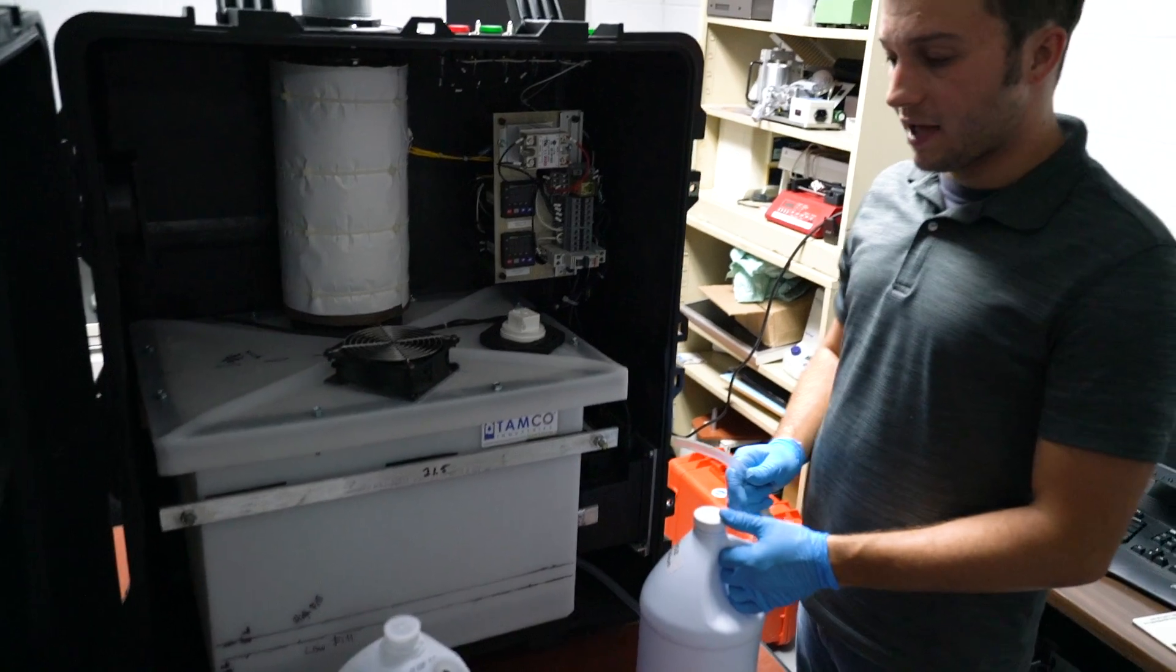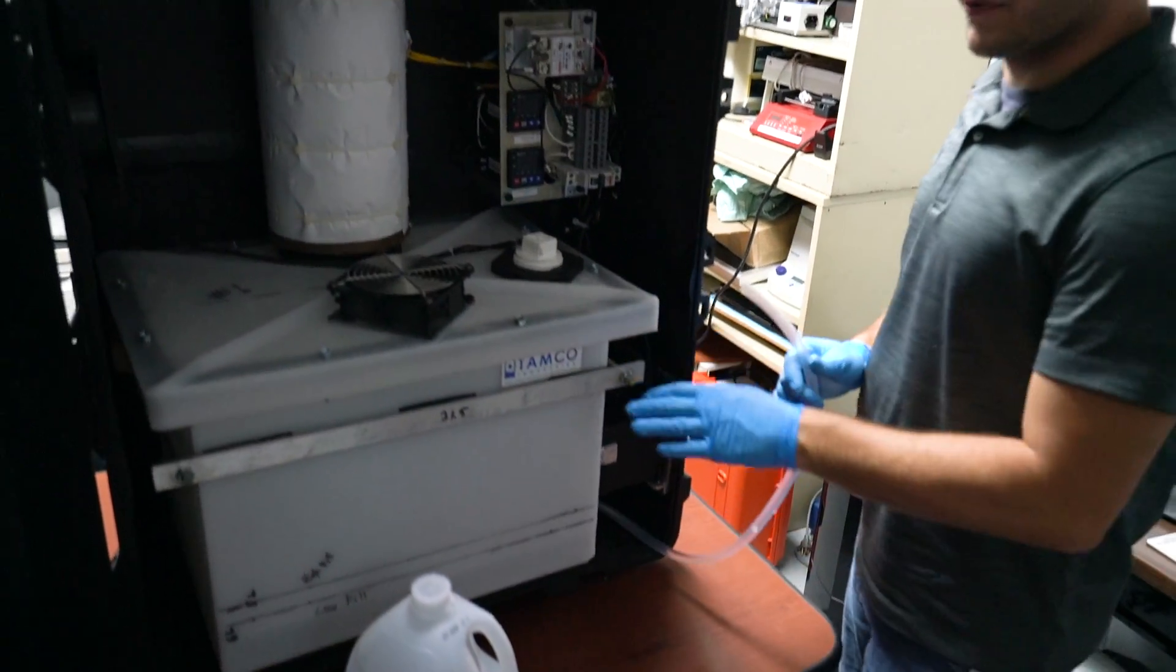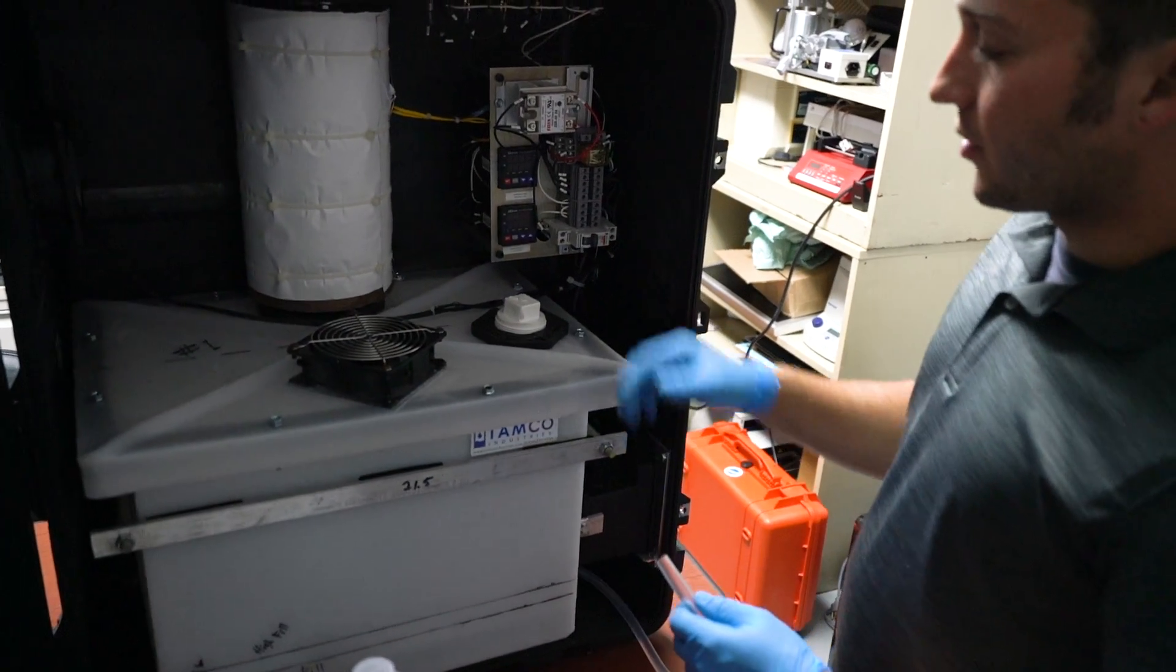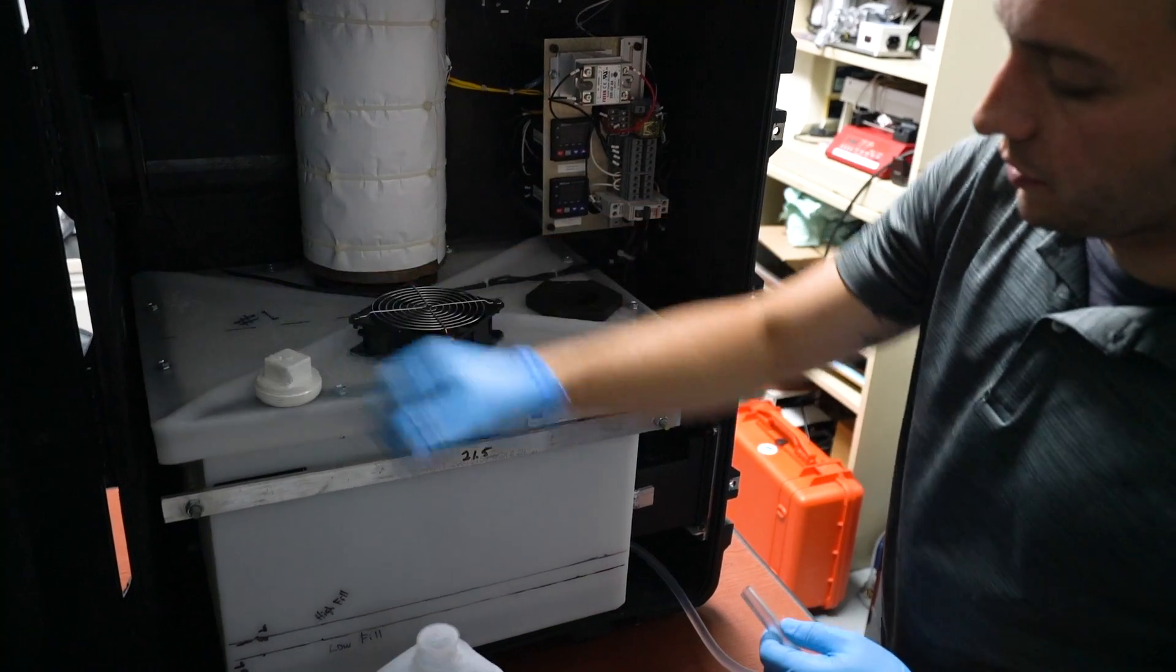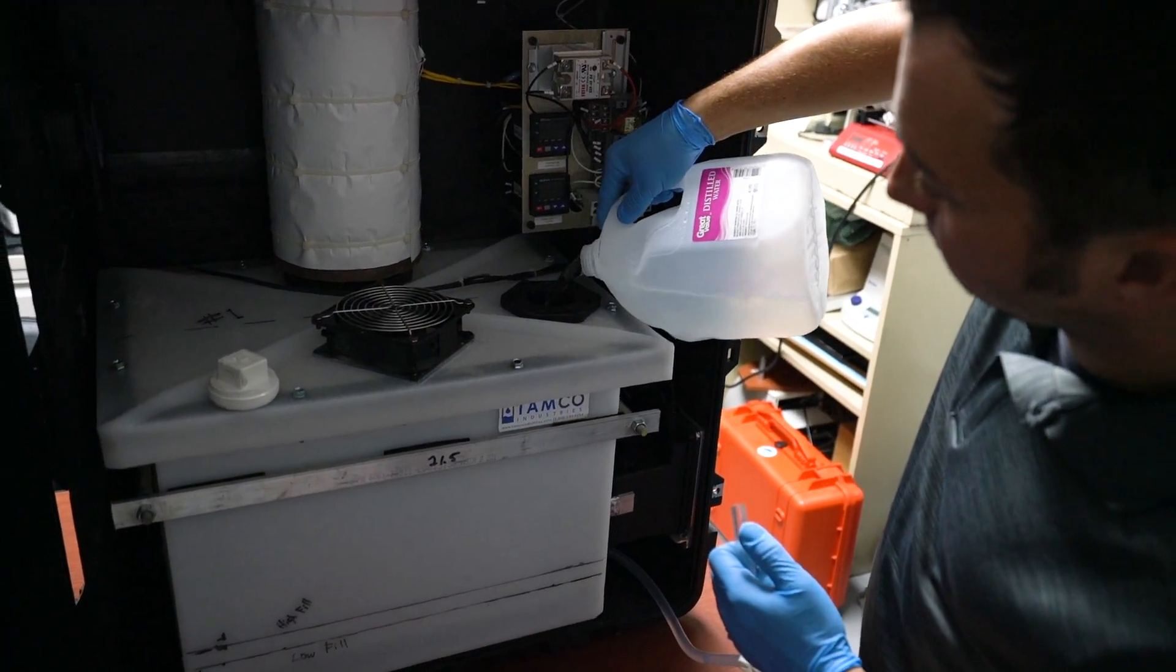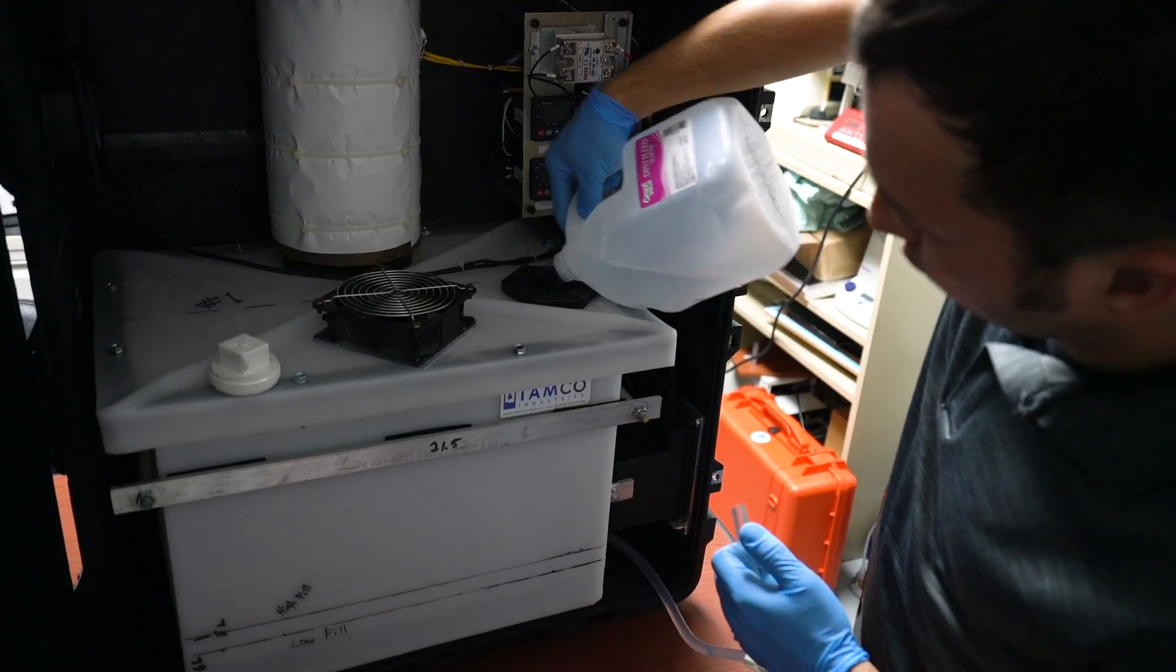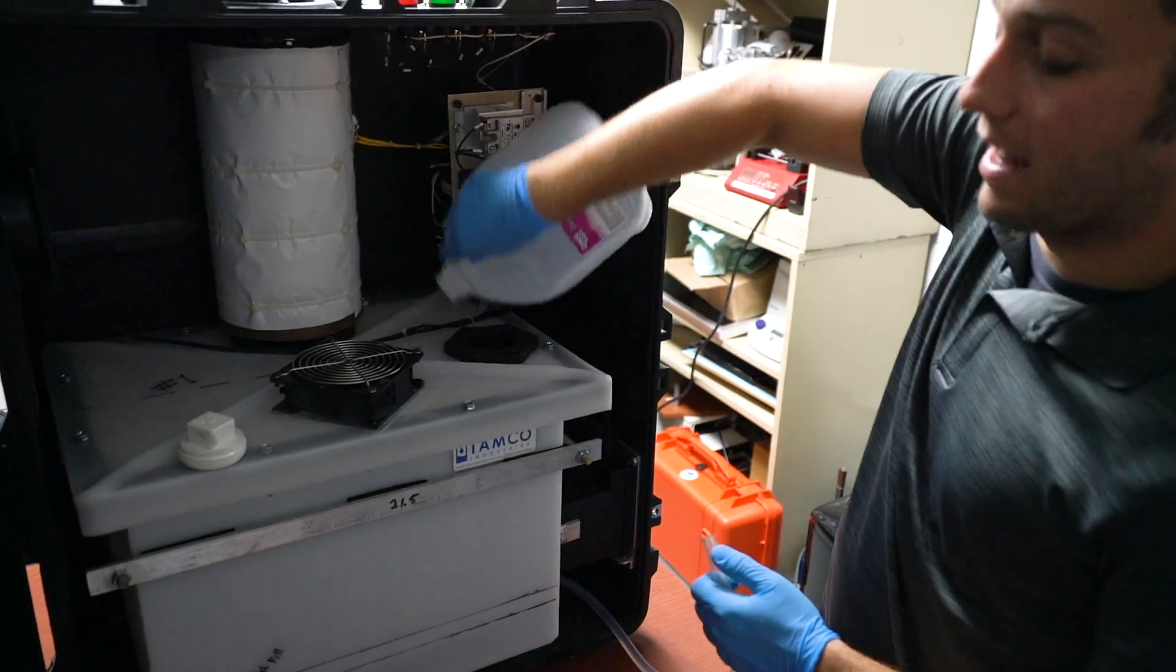Once the hydrogen peroxide solution has been drained from the reservoir tank, you will then want to rinse with distilled water. This procedure is done exactly like filling the tank. Remove the fill plug, pour distilled water. It is recommended to use at least a gallon.